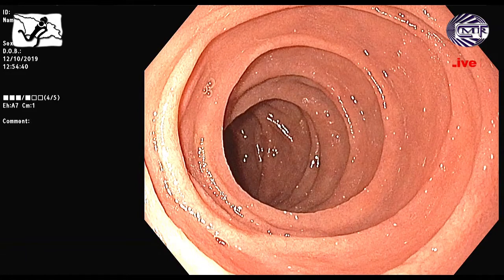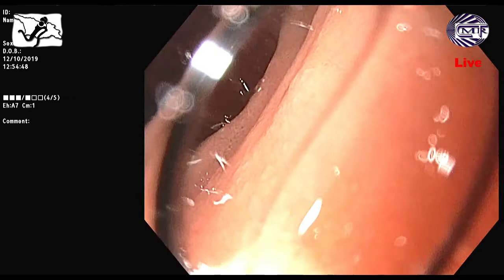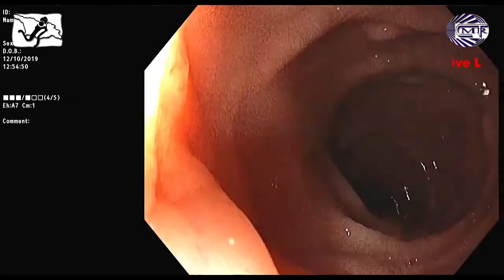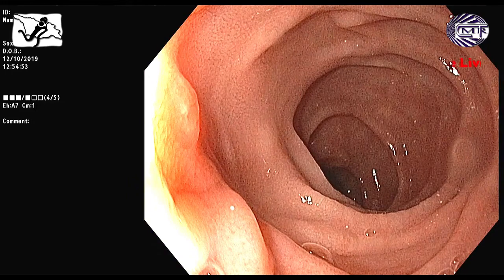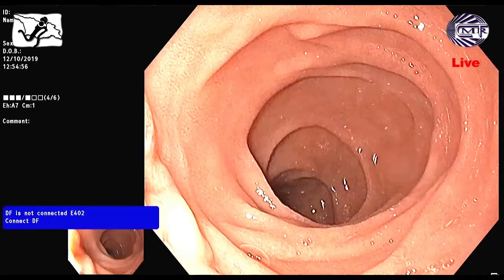Professor, what? Spray? Save the image. No. Save. Oh, save the pictures. Okay. Okay. For Europe. Yeah. Okay.